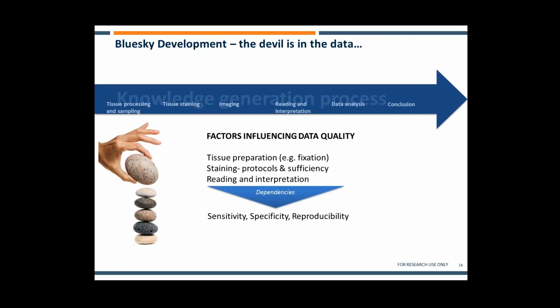Now, you've already heard from Hannah that some of these challenges can actually be solved quite efficiently using genetically defined reference material and cell lines, but it's also well known that manual assessment of biomarker expression is associated with significant inter- and intra-reader variability. And in some cases, there are also limitations when it comes to sensitivity and specificity of manual biomarker assessment. Now, when we start to fill out some of these holes and apply standardization, we get closer to a complete standardized workflow of working with human samples and also with biomarker development.